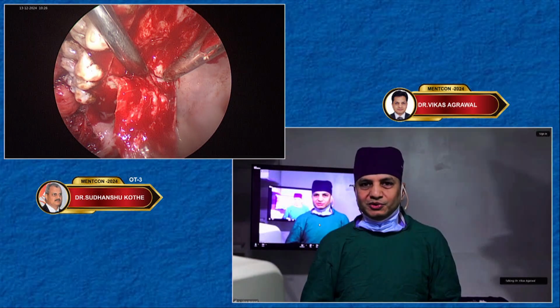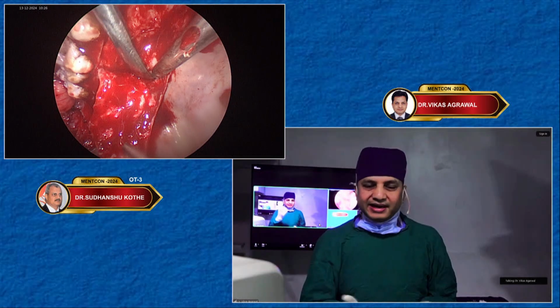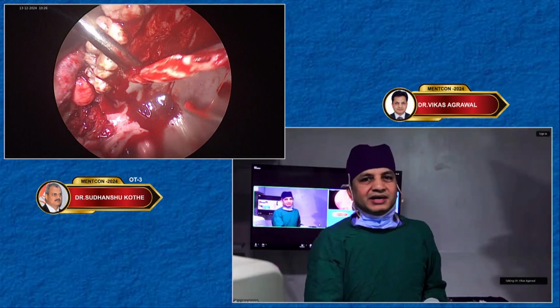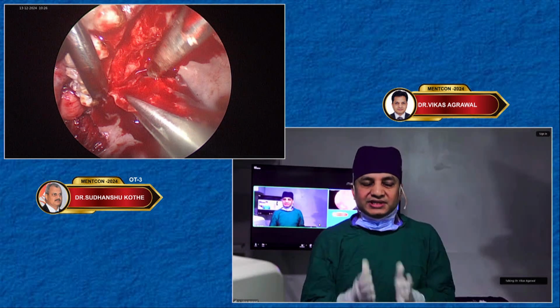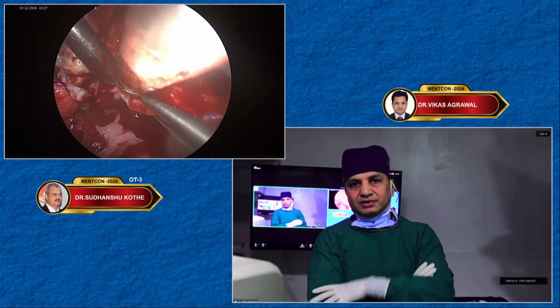That time there was no coblation. But we made sure that we removed each and every bit and coagulated it with suction cautery. See, if Satish did a great job with the debrider and the last bit with either coblation or cautery, you will get the same result as what I am getting. There is no difference in the result. I do it at times. So these are only different tools. You have different possibilities. It is your hand and the brain behind your hand which is more important.